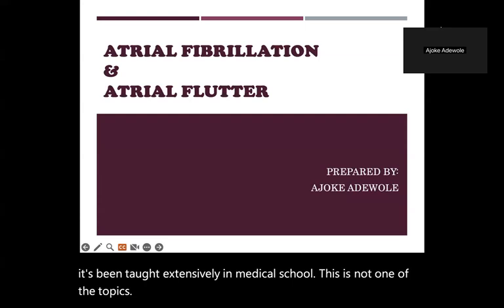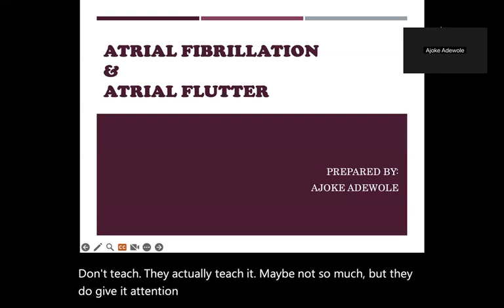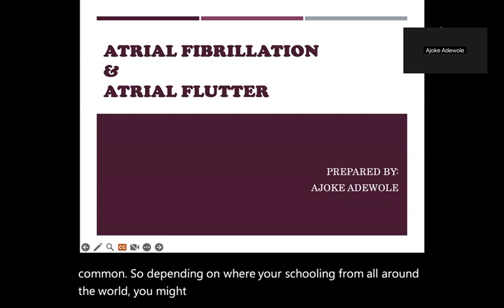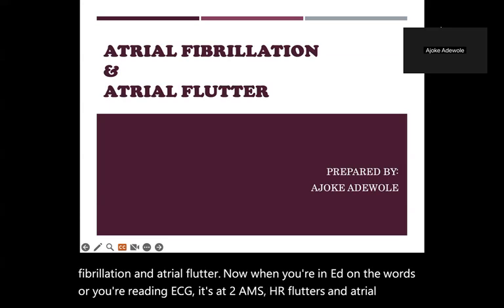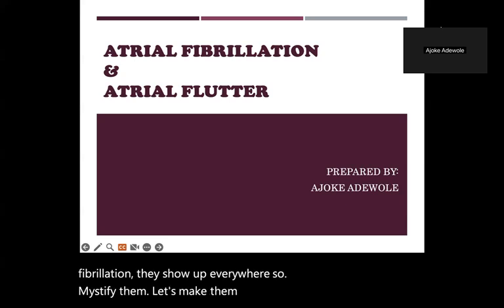They actually teach it, maybe not so much, but they do give it attention because they know that this is very common. So depending on where you're schooling from all around the world, you might already have heard about atrial fibrillation and atrial flutter. Now, when you're in ED, on the wards, or reading ECGs at 2 a.m., atrial flutter and atrial fibrillation show up everywhere. So let's demystify them. Let's make them stick. Let's make you confident.